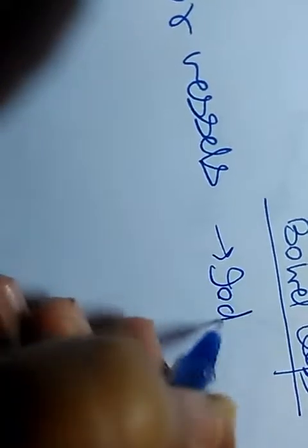But for vessels we use iodine as a contrast agent. Why do we use iodine? Because it has high atomic mass, and it markedly attenuates the X-rays.